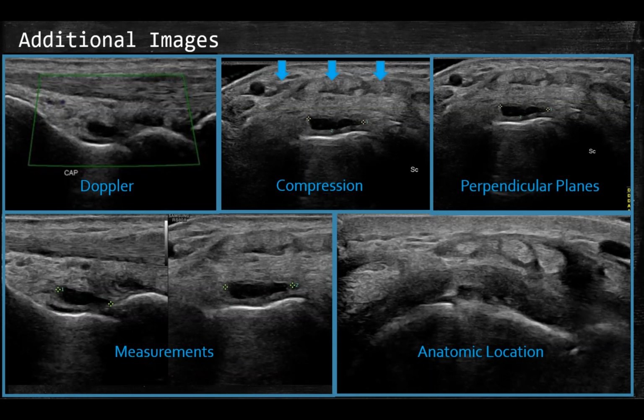Where does it start? Where does it go? What is its course? What are the adjacent anatomic features? The cine clips are very useful here. They can provide fine detail when really scrutinizing the anatomic extent of your lesion.